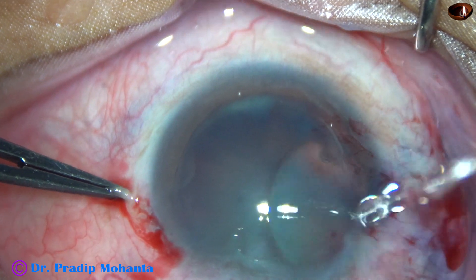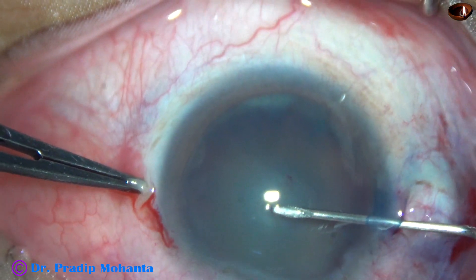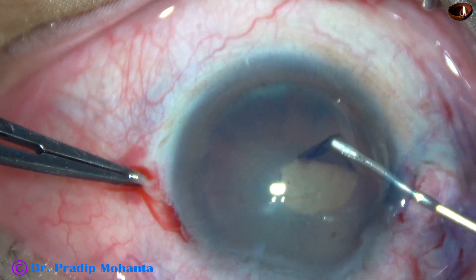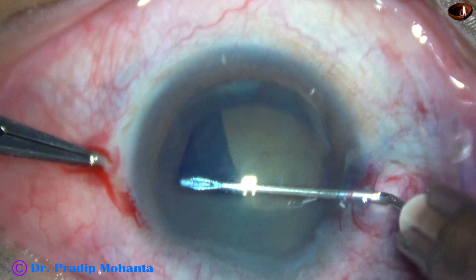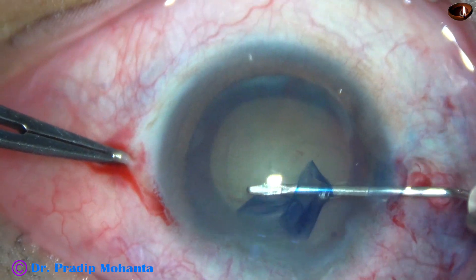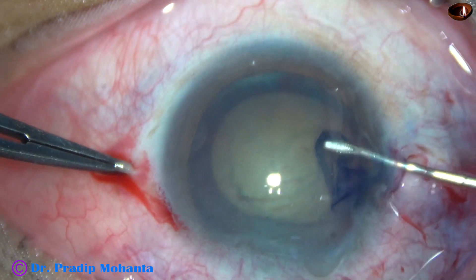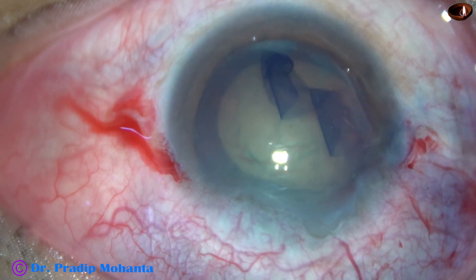I am using a 26-gauge bent needle for capsulorrhexis. I have used this instrument for many cases — thousands of cases — so this is easy for me. Capsulorrhexis is done.